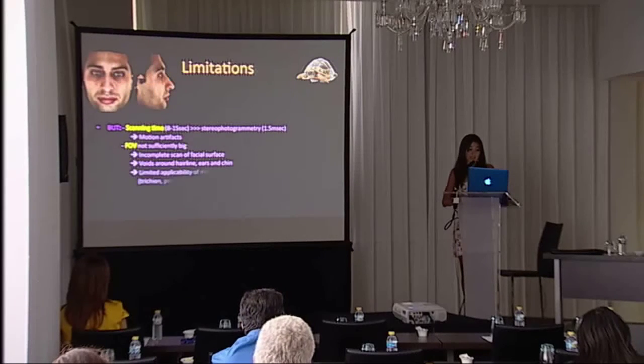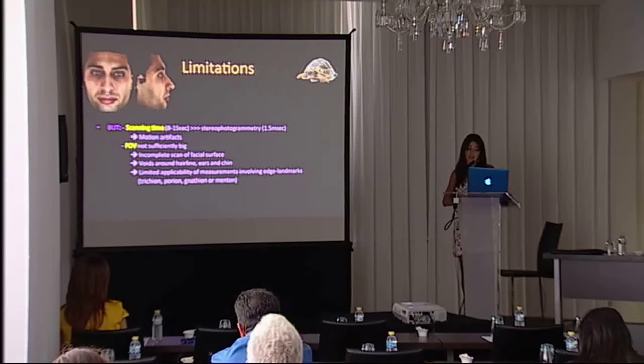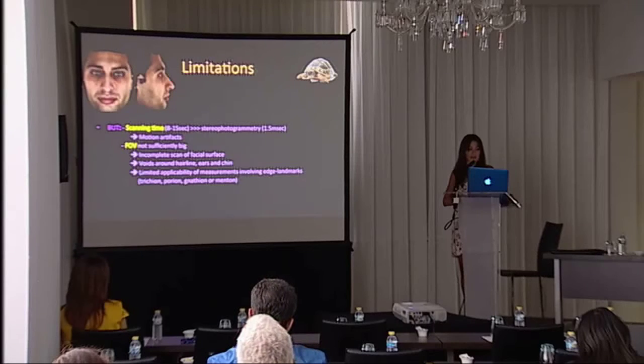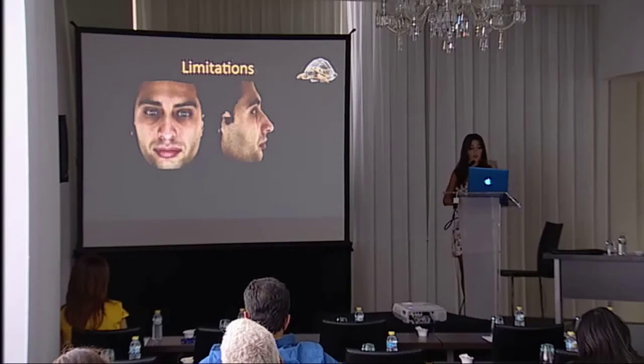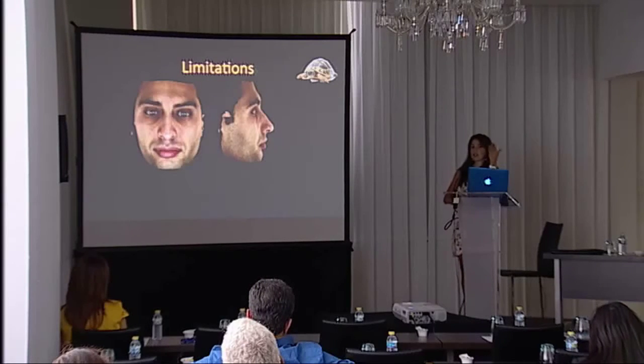Also, another limitation is the not sufficiently big field of view, which will limit the applicability of measurements involving edge landmarks, as you can see here. So the lower part of the chin is cut, and there's voids evident around the head, the hair.